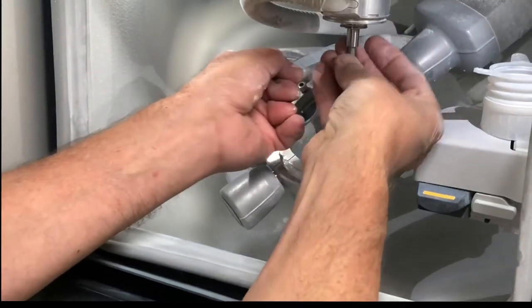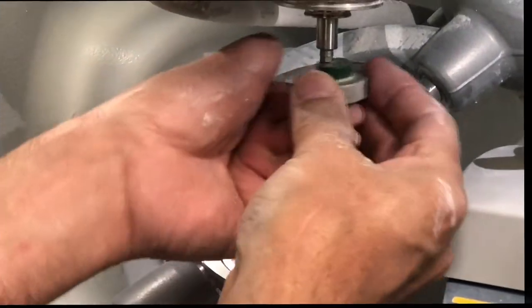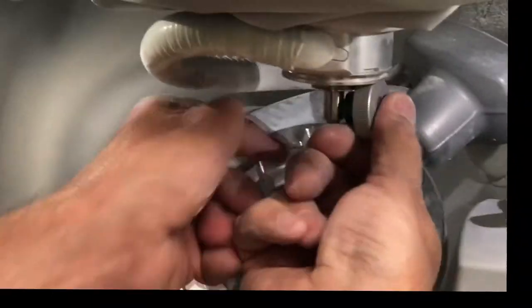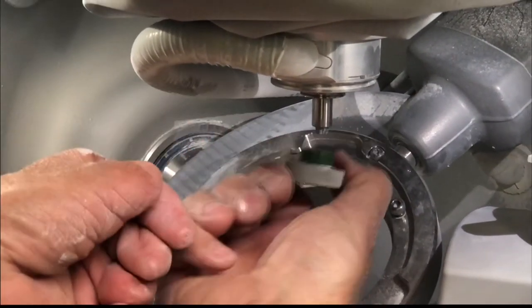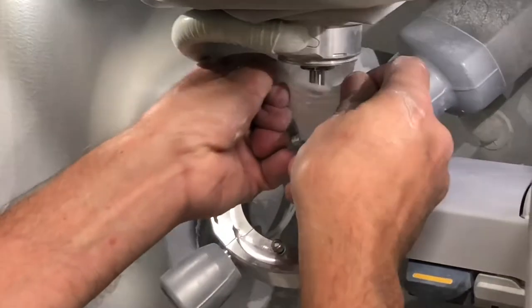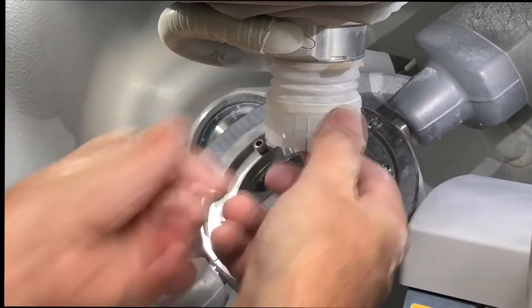It goes back in. Start screwing it on. Take your torque wrench — I like to torque it down twice once it's tight. You'll hear two clicks: there's one, and the next one — two. Put the cover back on and make sure it's on correctly.